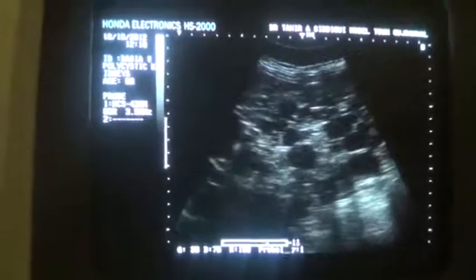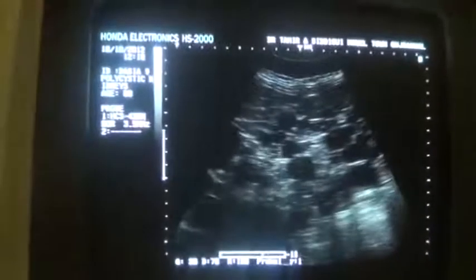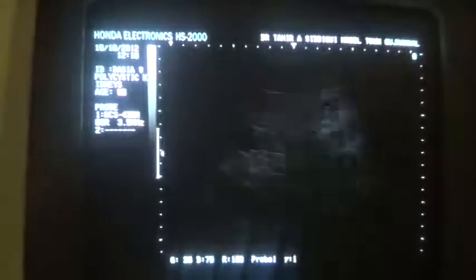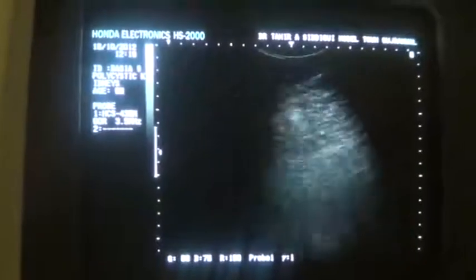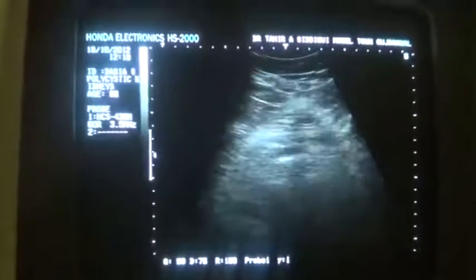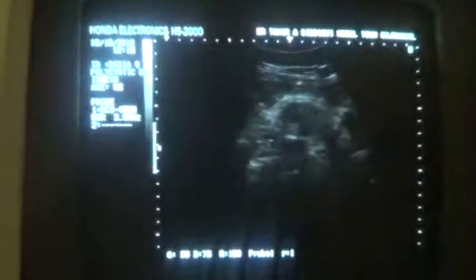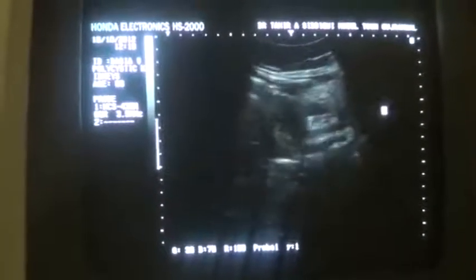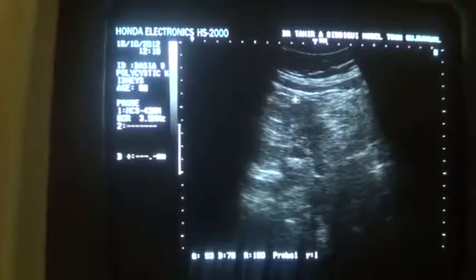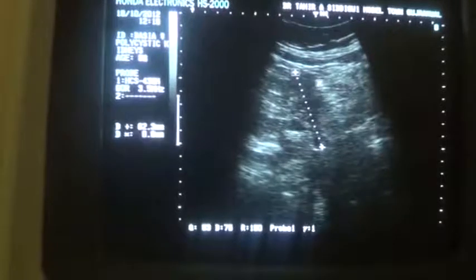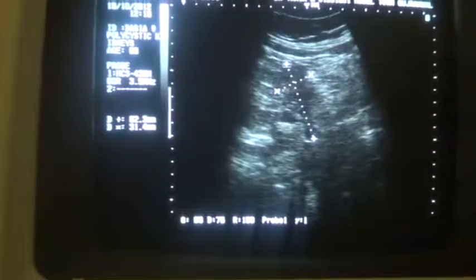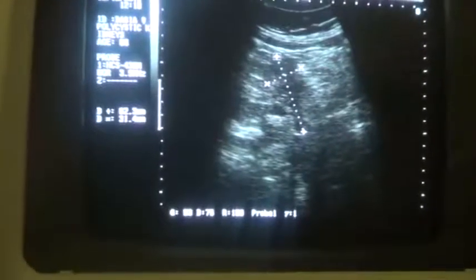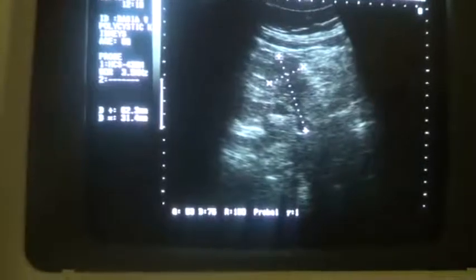Now let's see the pelvis of this female so as to see the urinary bladder. At the time of ultrasound the patient is not holding urine — the urinary bladder is empty. And this is the postmenopausal uterus. Age is 55 years; uterus measuring 6.2 × 3.1 cm — it's postmenopausal. Now whenever we see cysts in the kidney there is always a chance that there may be cysts in other organs as well, especially the liver and the pancreas.